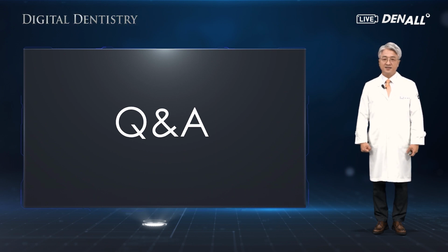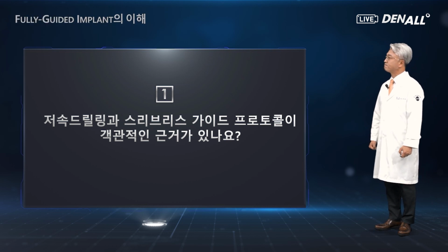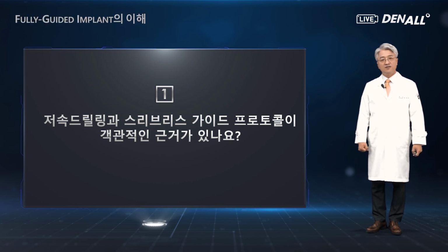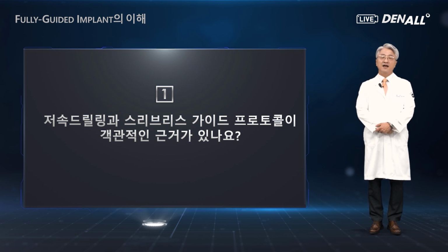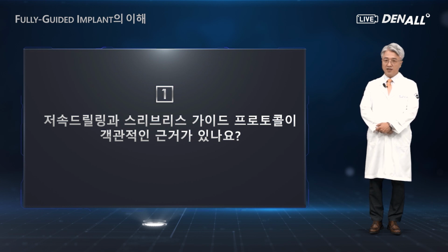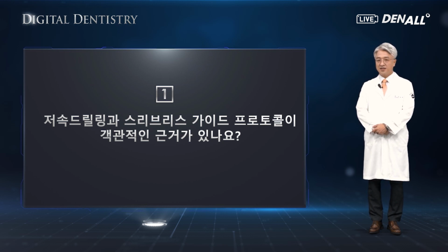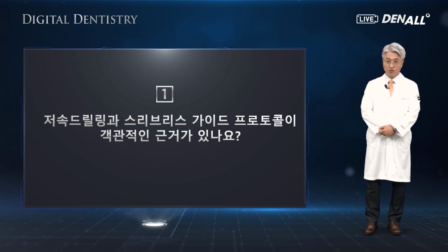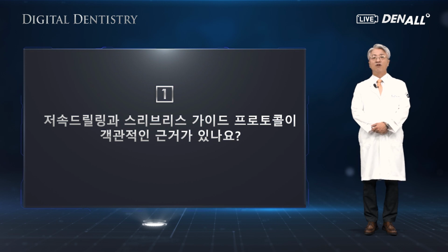Q&A. So let's look at some questions. Low-speed drilling and sleeveless guide protocol. Is there any objective evidence for that? The protocol actually doesn't have objective evidence. I have done guided surgery for the last 5 to 6 years. I used various approaches, low-speed or high-speed drillings, and I've experienced advantages of one over the other.